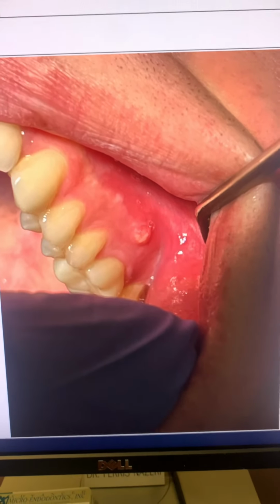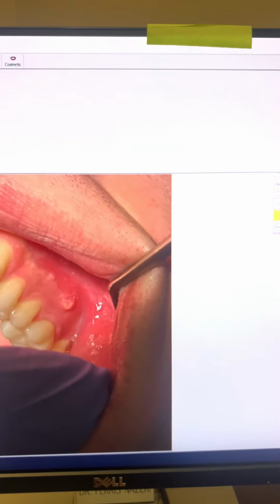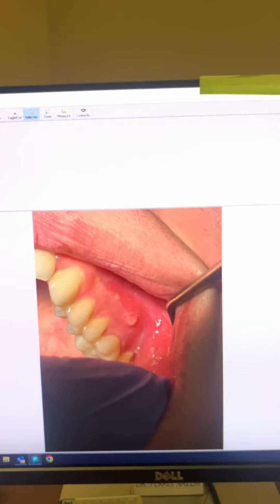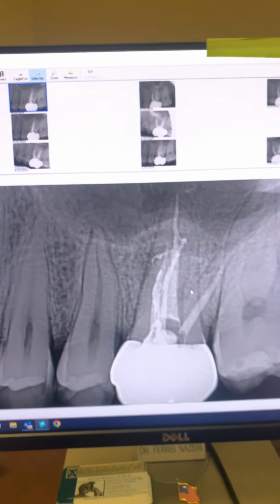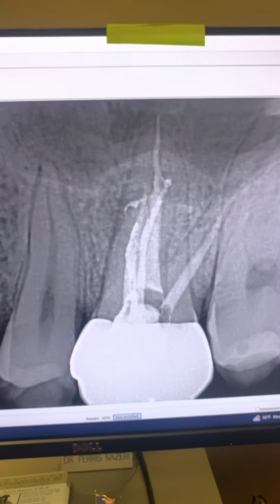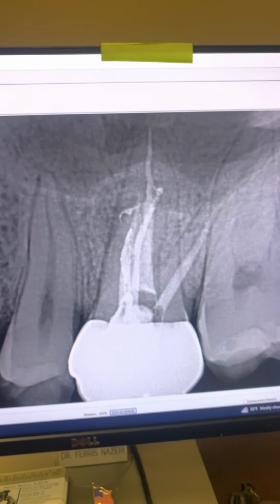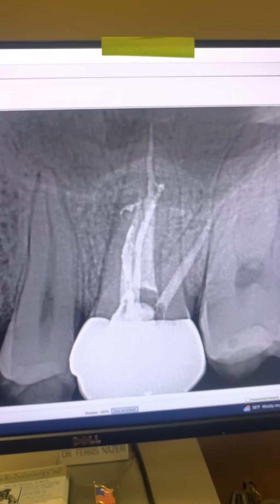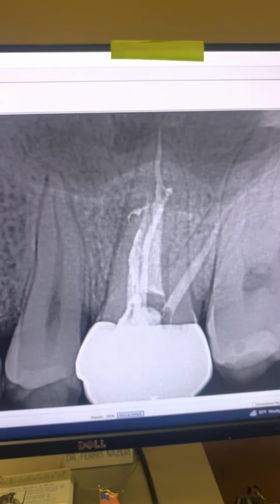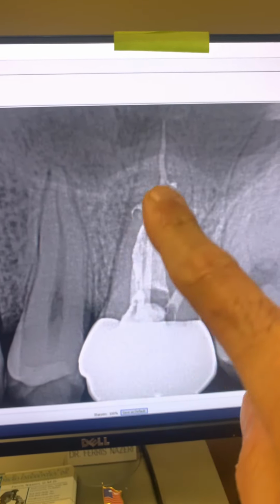All right, very good. So again, the patient is only 18 years old, so we went ahead and redid the root canal for him in one appointment. Kind of selective endodontic retreatment. So take a look here. You can see the missed MB2. There was actually an MB3 also, so I found MB2, MB3, and then once I instrumented MB2 and MB3, they joined.